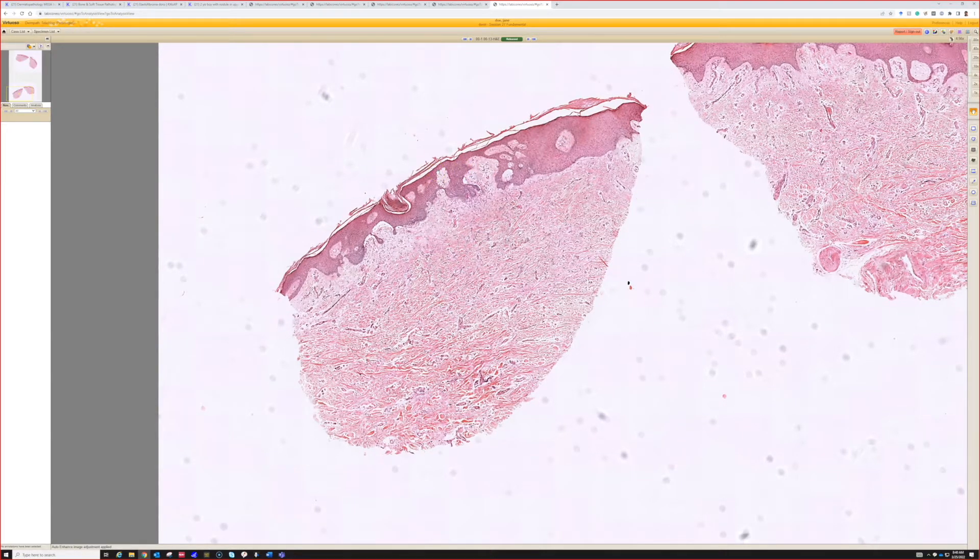We can tell that there's something going on in the dermis. We can see that there is epidermal induction a little bit.